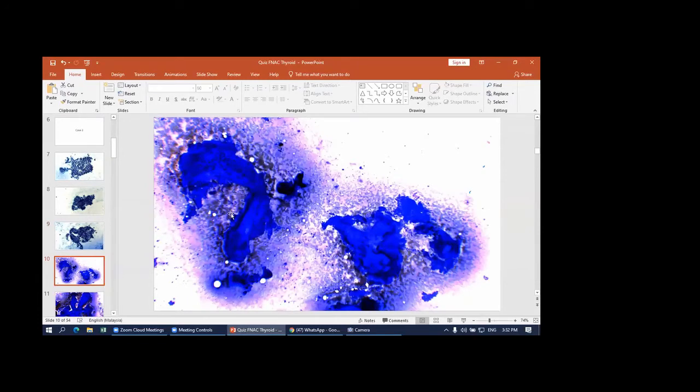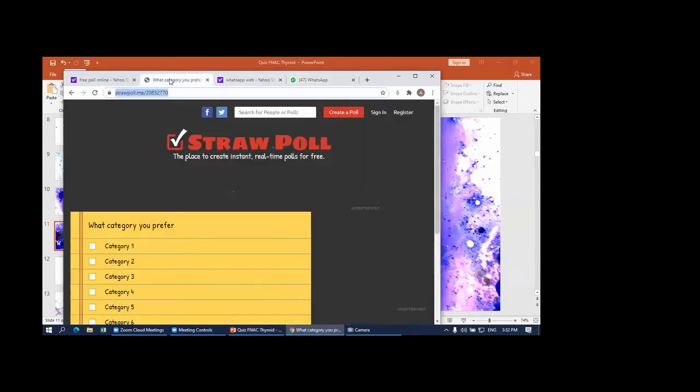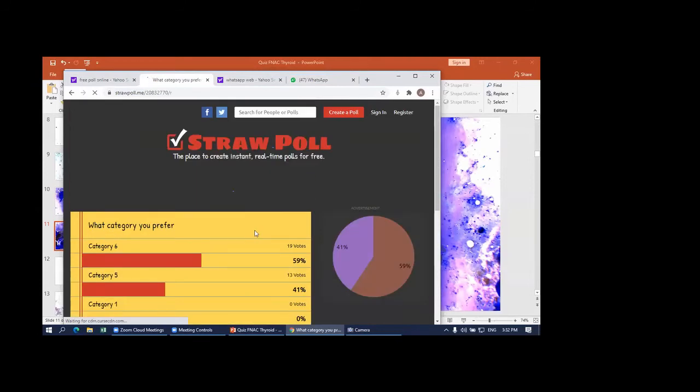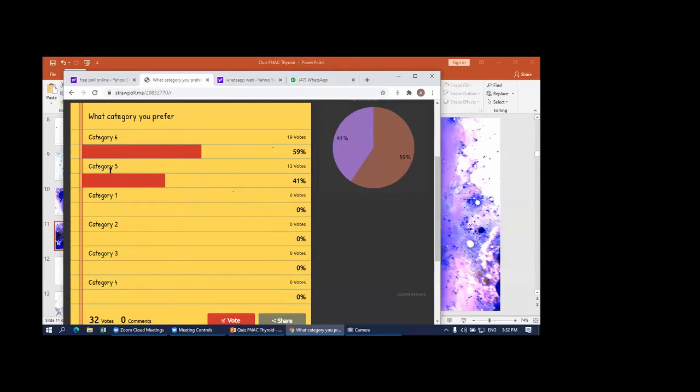You can see the architecture, and also this center thing called fibrovascular core. So let's see what your diagnosis is. Quite a number are not so confident to call it PTC, but because the cellularity from what I've seen is quite high, that's the reason why I put it as PTC itself.